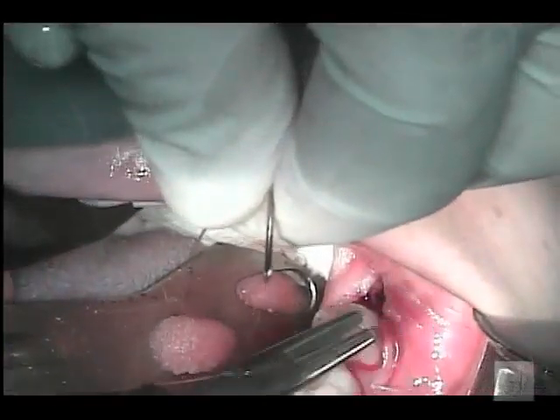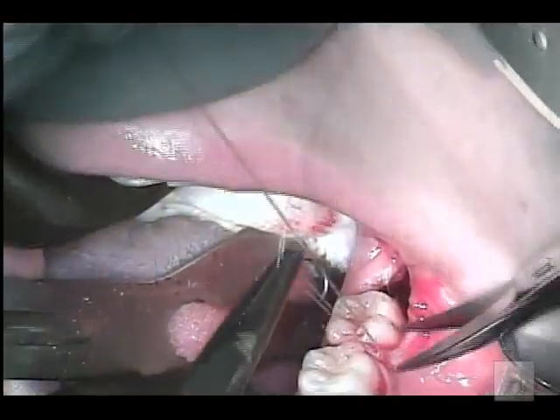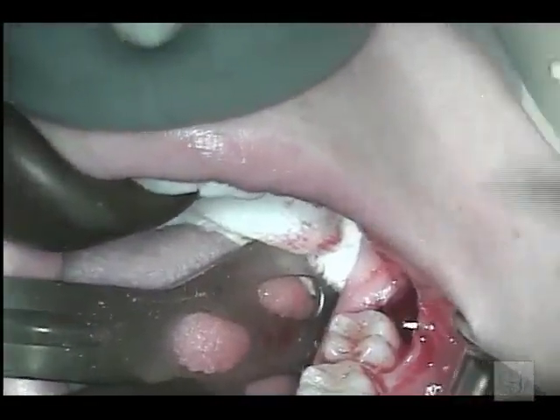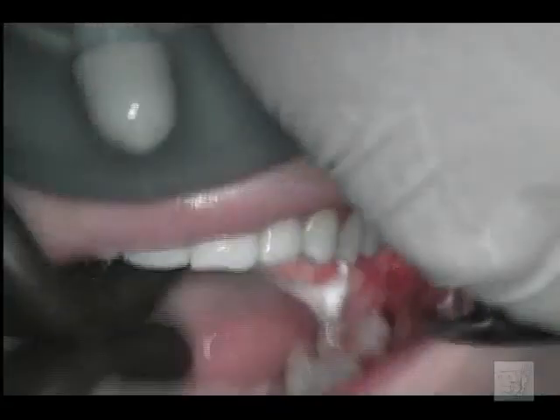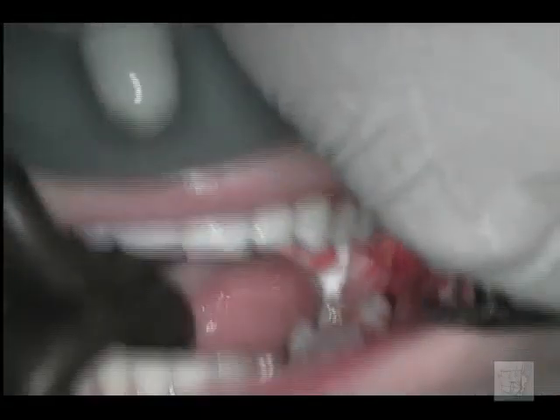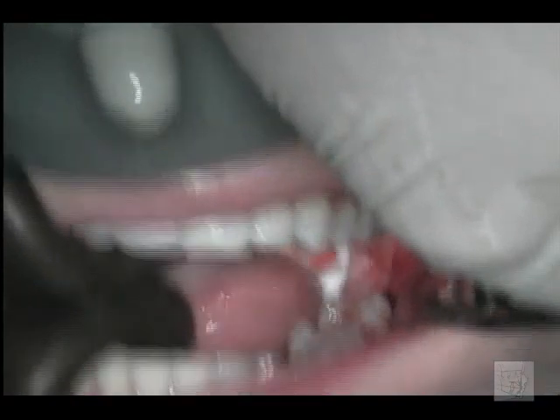And you'll see the incision at the distal aspect over the third molar, I actually generally leave open. When the cheek is reapproximated, you'll see that incision actually comes back together pretty well. And we know from studies that have been done that if you close the incision in a watertight fashion, the patient actually has more post-op swelling and discomfort, and so you're actually better off just to leave it open a little bit so that it can drain. And so basically that's all there is to removal of a fairly straightforward mandibular partial bony impacted wisdom tooth.